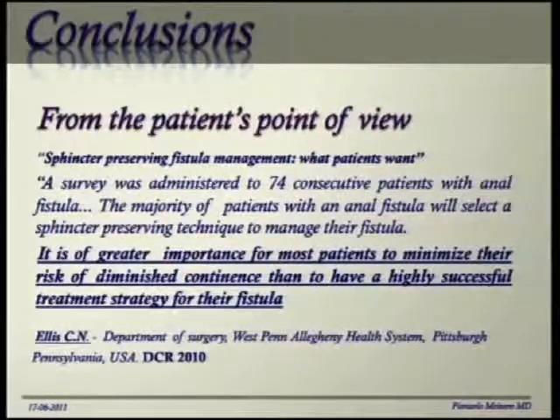I suggest that you use the fistuloscope for all types of fistulas, both simple and complex, as a diagnostic instrument to identify any possible secondary tracts. In the case of a simple fistula, after fistuloscopy you can remove the fistuloscope and perform the operation you want.